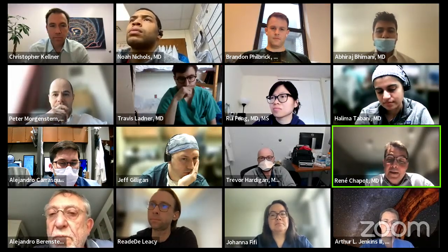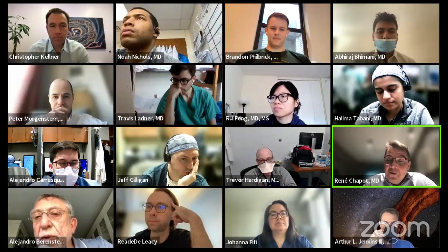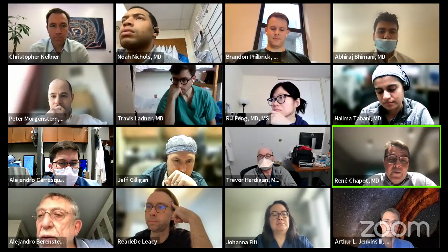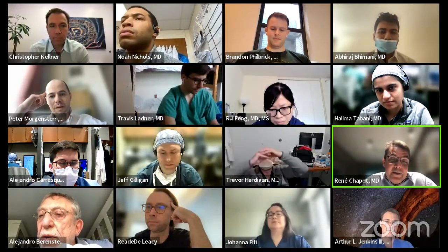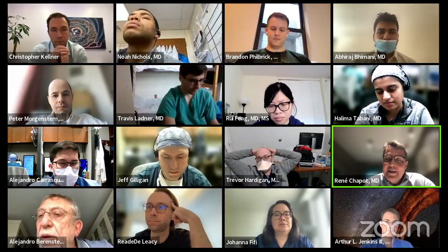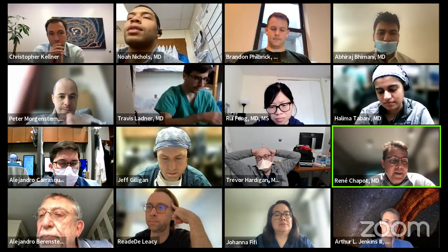because usually when I'm shown a complication, the comment is, we've been going through the vein, we've been occluding something, then there was no AVM to be seen, and we stopped and the patient bled. The problem is when you occlude the vein, you won't be able to see the early vein anymore, which is usually the criterion to say the AVM is still there. So underembolization is probably quite important.